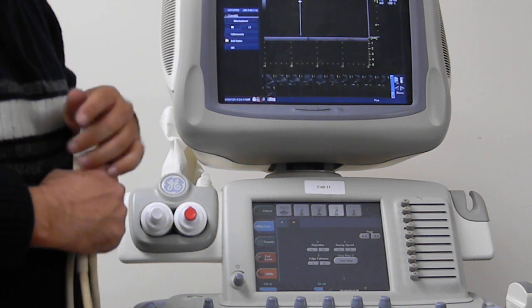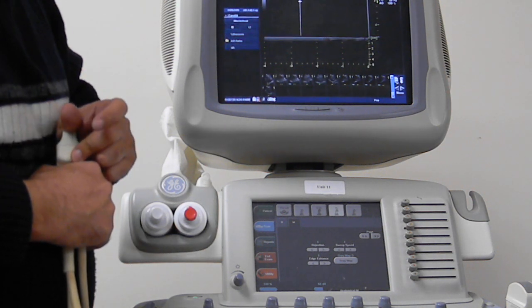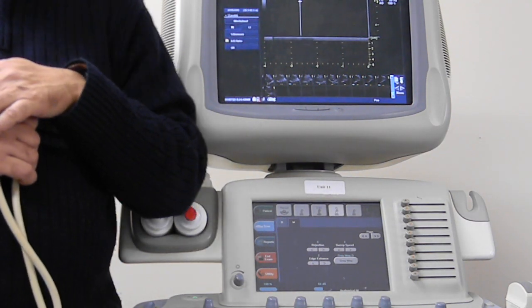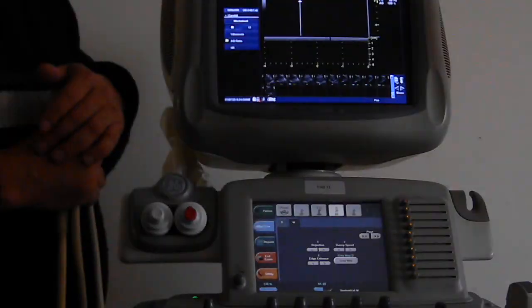Maybe not. You can't really see anything unless you have gel, right? Somebody just turn off the light there. Let me have a look. Okay, good.